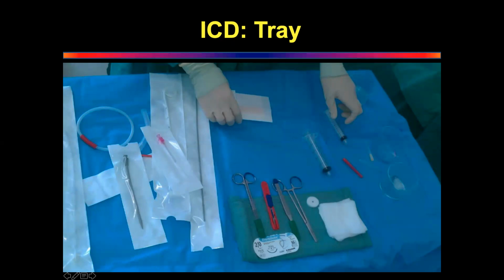What are all these needles for? What are the two needles for? You just told me the two syringes. One is for local. What are the two needles for? Okay, one is for local and one is for aspiration. Just with respect to the syringes.